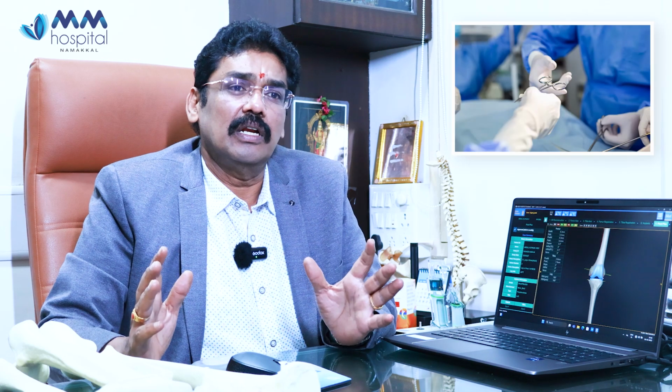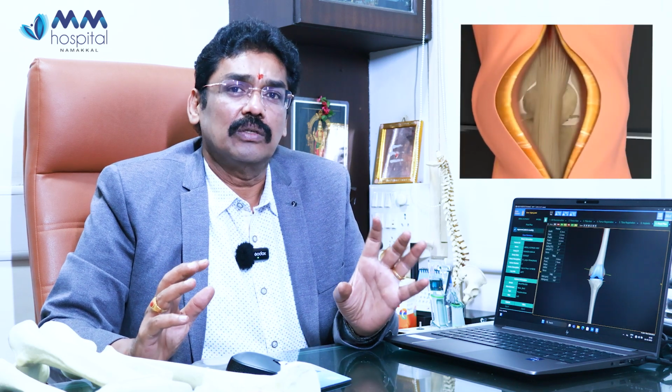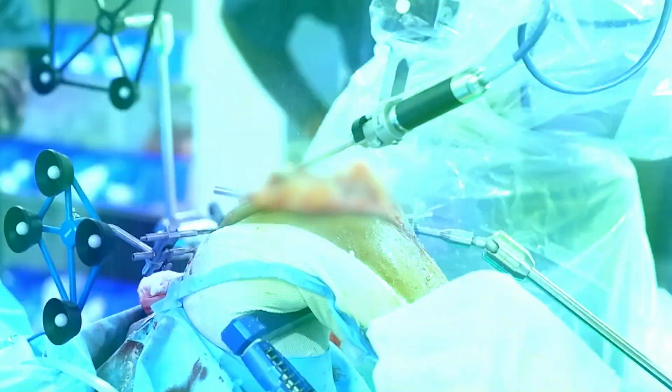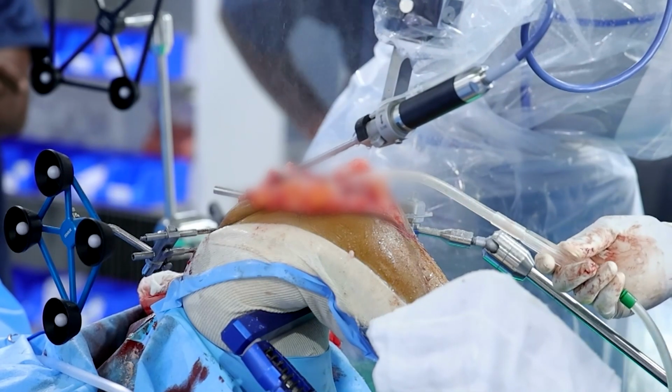In conventional surgery, we use a lot of jigs, but in this there are no jigs. The software has been developed and the cutting is so perfect. I can surely say that the outcome of the surgical results and the range of motion of patients in robotic replacement surgery is really accurate and successful compared to the normal replacement surgery.